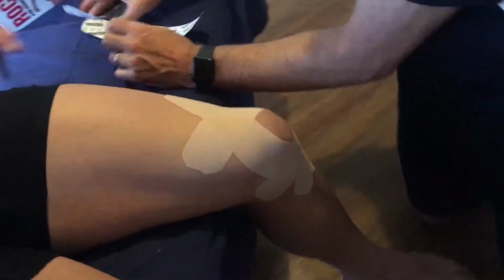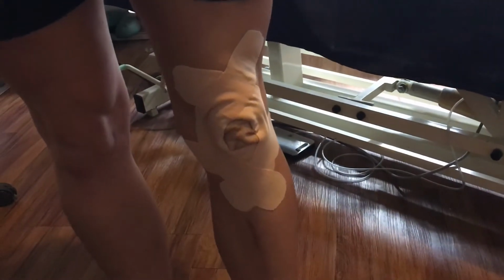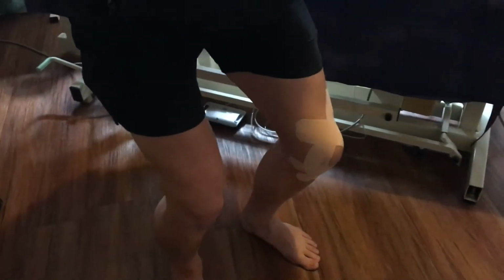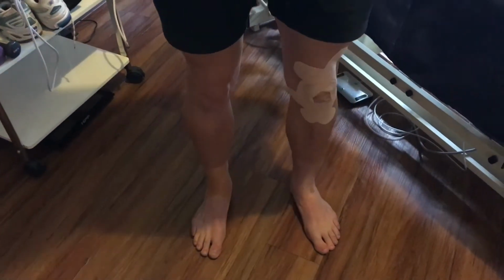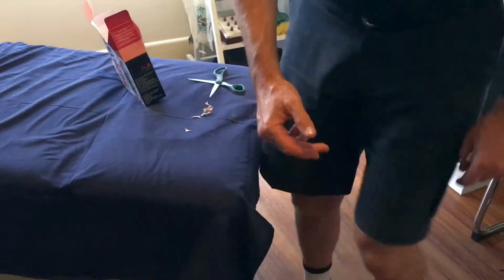Alright, just stand up, Lockie, and you end up with a few wrinkles and things where the tape looks a bit like an anemone, but basically the tape, when your knee is bent, that's when you need the most support, and you can see that the tape takes up tension when you've got it under a little bit of load. So it's a good one for those problems underneath the kneecap, underneath the patella tendon, so underneath that tendon there.